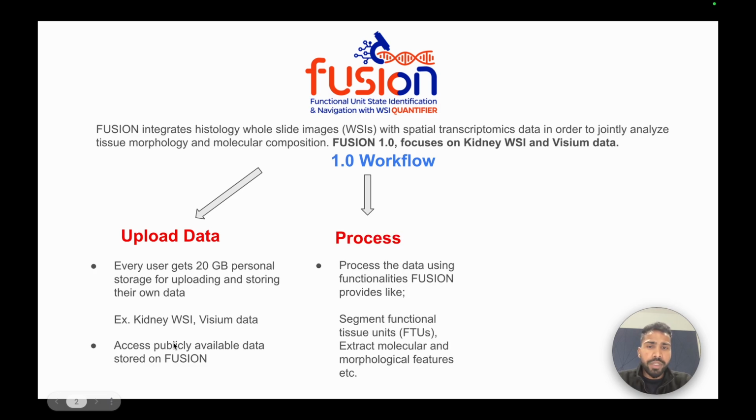The second step is process, where they can use the built-in tools, which we call plugins, to perform various tasks like segmenting functional tissue units, which can be glomerulus, tubules, or any other biologically meaningful compartments. They can also extract molecular and morphological features, aggregate them, etc.